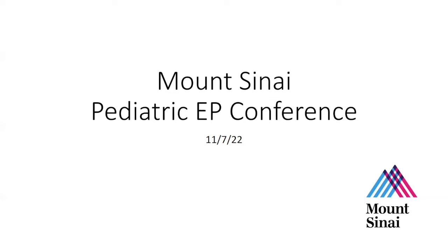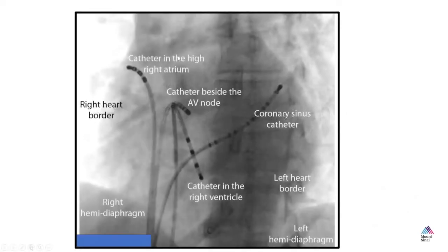Okay, good morning. So I just wanted to start today by going over the intracardiac catheters, just to remind everybody, because sometimes I think I assume things that are not true. So this is the LAO view of the heart. We use this, of course, as well as Carto. It seems like every time we do a case, the tech has closed the computer before he's made a picture for me. So just to remember the basic electrophysiology catheters.